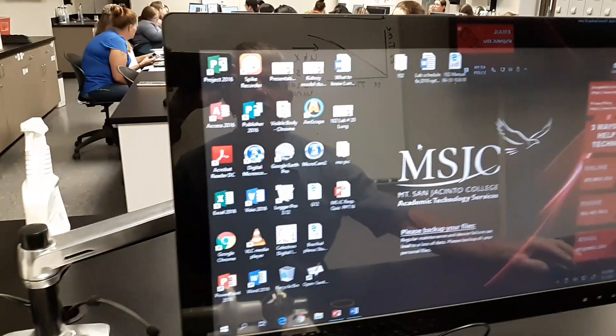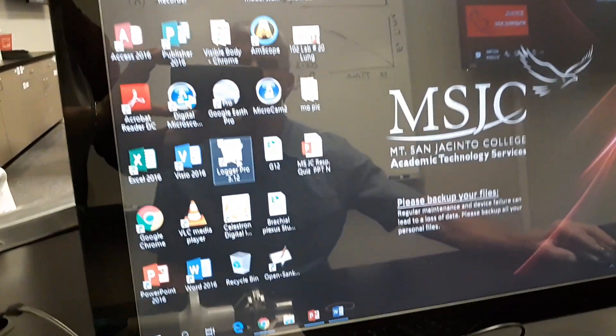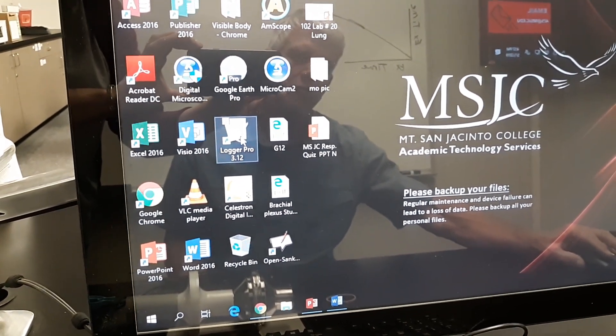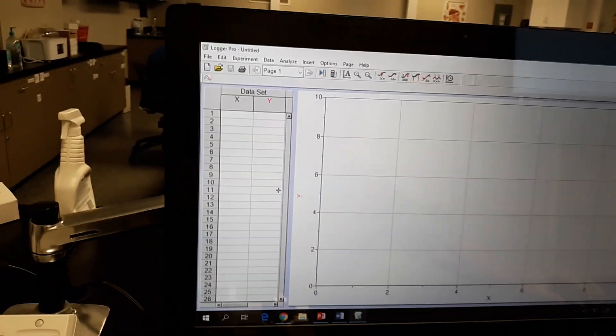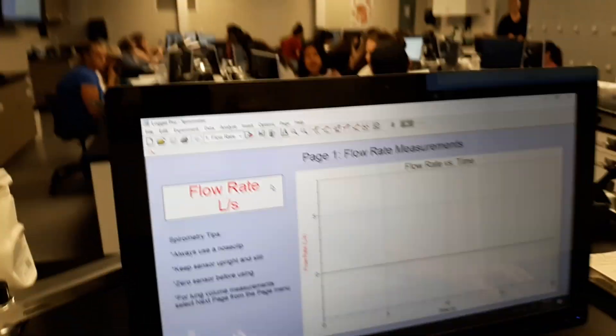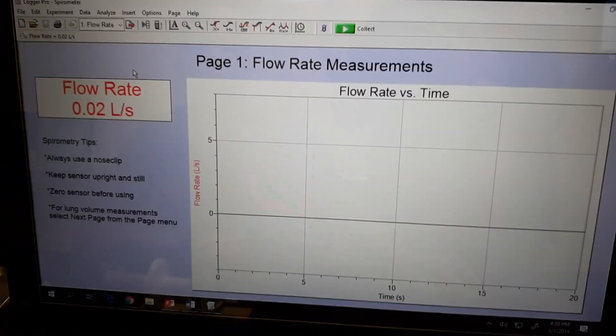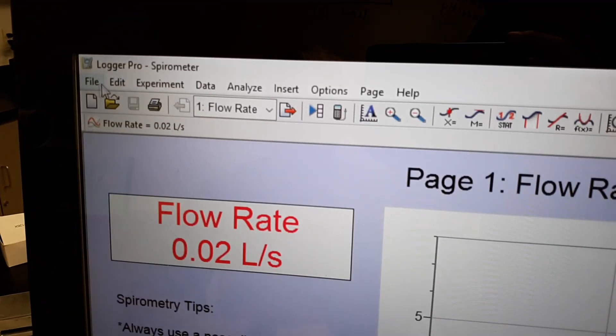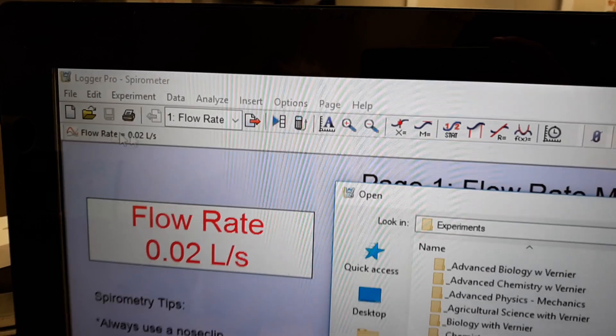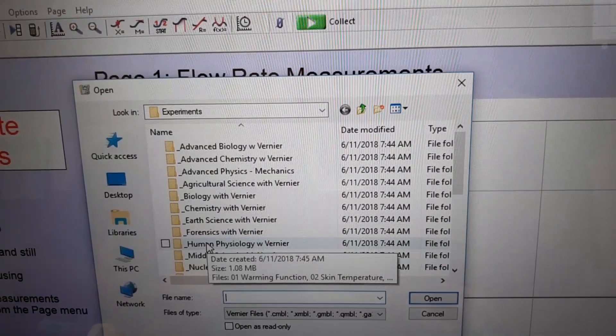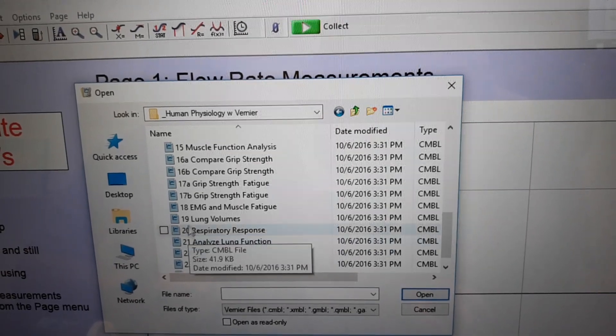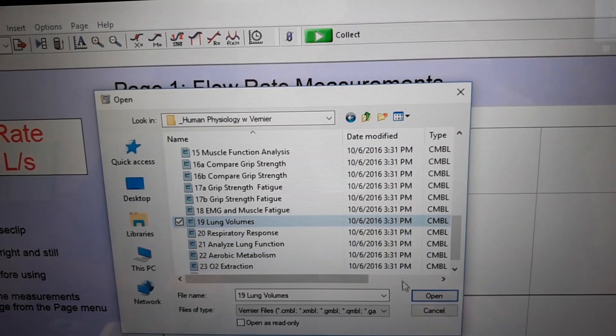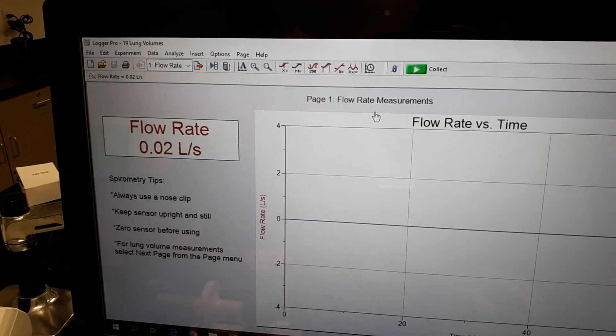Let's take a look at what we need to do for our computer. So the computer program we're going to be working with is called Logger Pro right here, and they're going to be in different spots on each computer. So just have a look around, go on there, double click. And then what we'll open up is this graph. And we actually want to change this. We're going to make this a little easier to read today. So once you get, this will probably come up the flow rate measurements here. What you want to do is go up to File and hit Open and you'll get this drop down menu here. Go to Human Physiology with Vernier and double click on that. And then scroll down to number 19 lung volumes. You can double click on that or single click, then hit open.